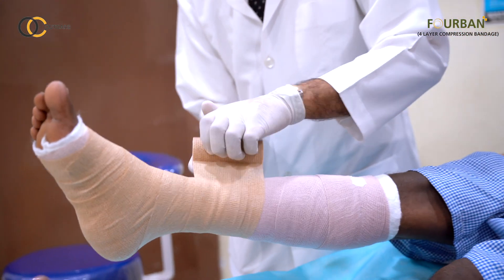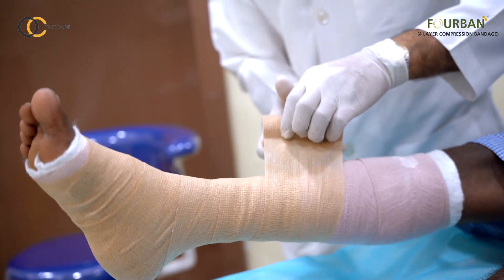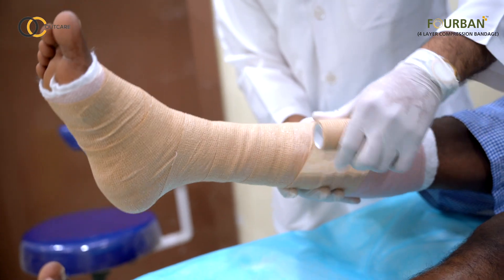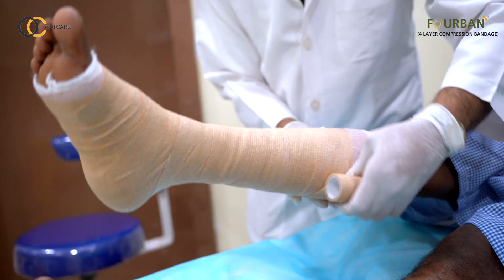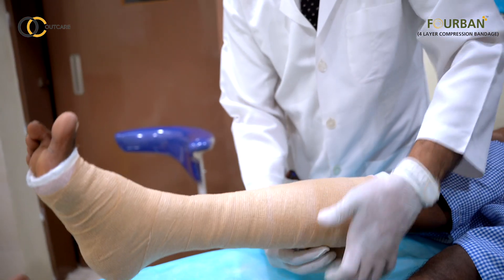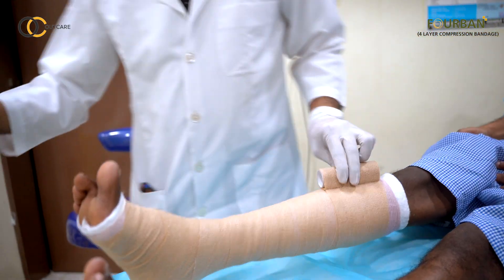This layer of the compression bandage contributes around 20–25 mmHg of pressure, and the third layer contributes around 15–20 mmHg. In total, we are aiming to give a pressure of around 40 mmHg, which is beneficial for the healing of venous ulcers and lymphatic conditions.